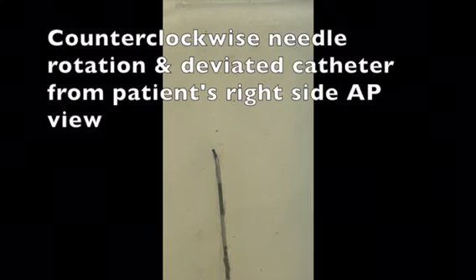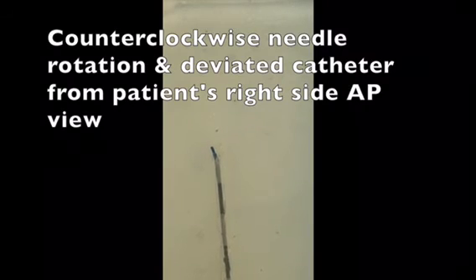And then I will take the catheter back and rotate the needle more, re-advance the catheter again, and ask the patient, where do you feel the pressure? The patient will say, I feel the pressure in the middle of the back. So I then advance the catheter by 4 centimeters in the epidural space, and I assume the catheter is in the middle of the back, in the epidural space.